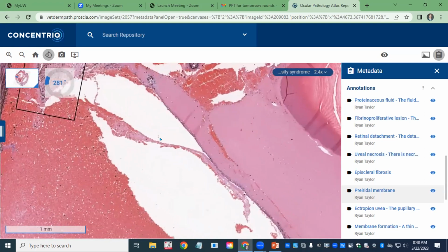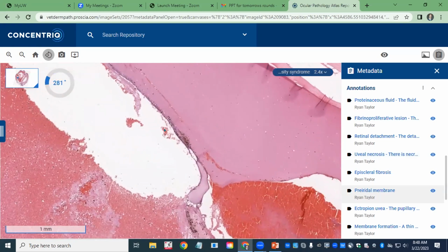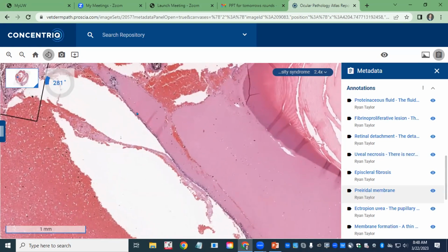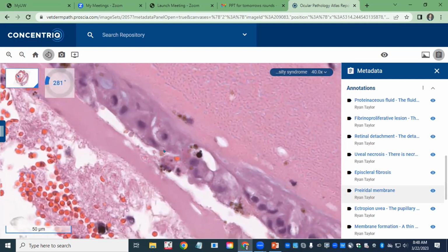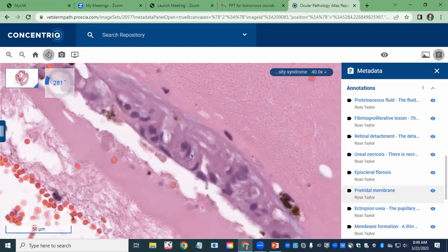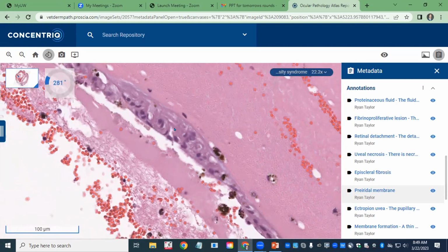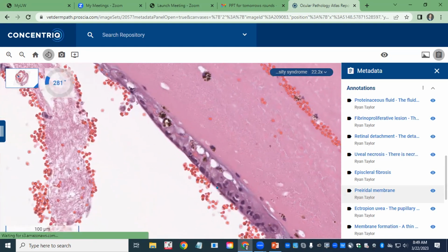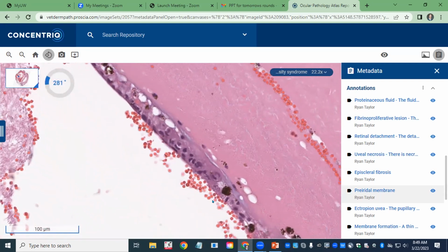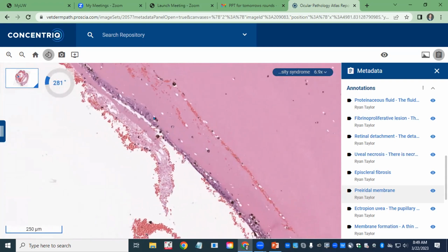It's okay. So then we've got the detached retina, which we were able to appreciate grossly. And as you can see, this is the retina. It's just a fine little barely hanging on fiber of a retina. If we go closer, these are retinal cells of some kind, probably. Do you say retinocytes? Yeah. They have mostly lost their identity. Maybe here's some of one of the nuclear layers, hard to say. The point is there's a lot of atrophy of this retina and most of the retina is lost.